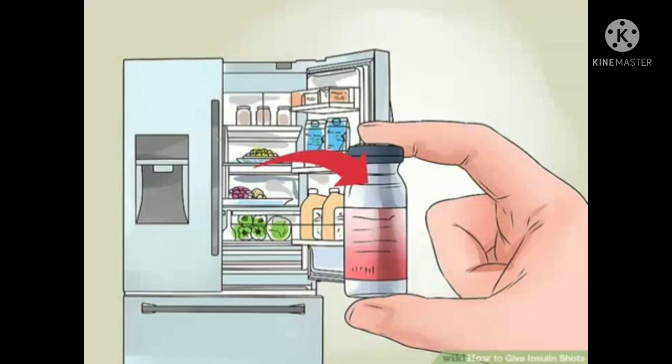Take the insulin out of the fridge. Insulin is typically stored in the refrigerator because the colder temperature deters it from spoiling or going bad — the cold essentially preserves it longer. However, you should only give insulin shots once the insulin is at room temperature. Take the vial out of your fridge about 30 minutes prior to injecting it to give it enough time to warm up. Never microwave or boil it, as that will destroy the hormone.